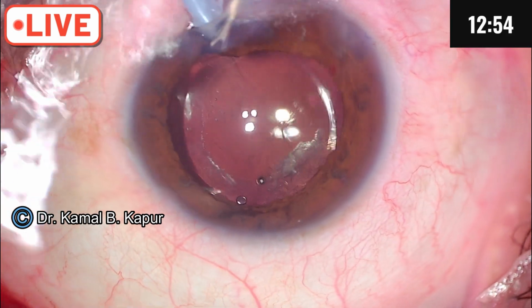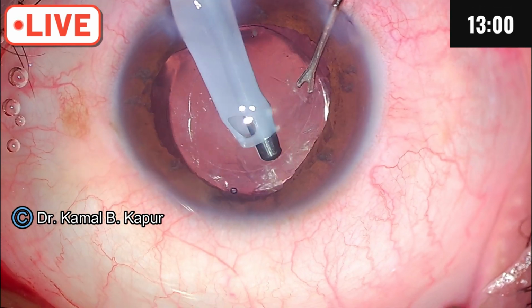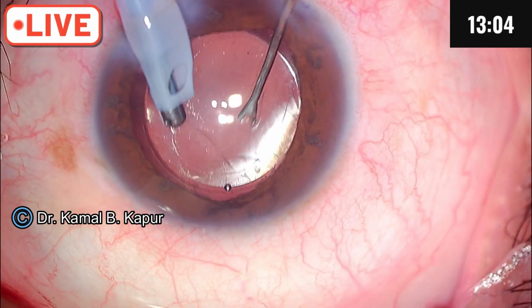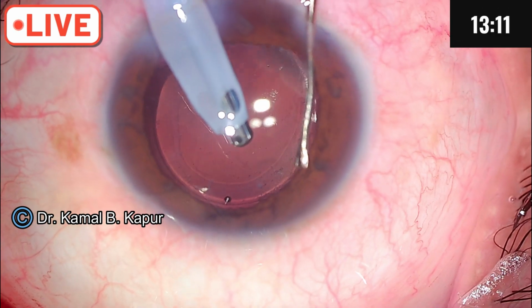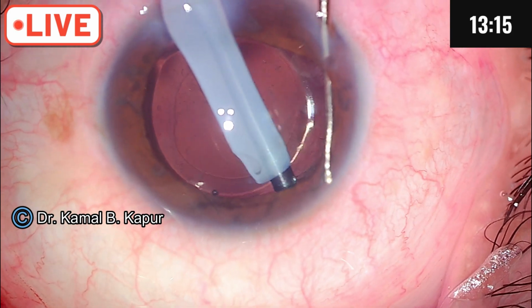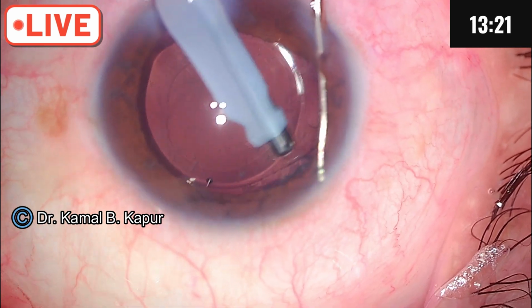Now we are going in with the bottle height. We are going in the bottle height, and then we will see that the surgery has been done beautifully. The IOL is absolutely centered. There is some amount of residual cortex. We will try and go for it, but in case we cannot take it off, we would not risk losing the bag.